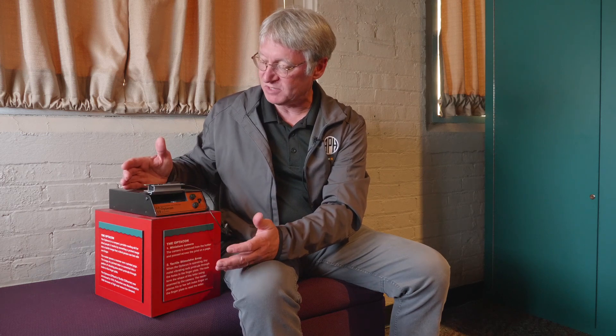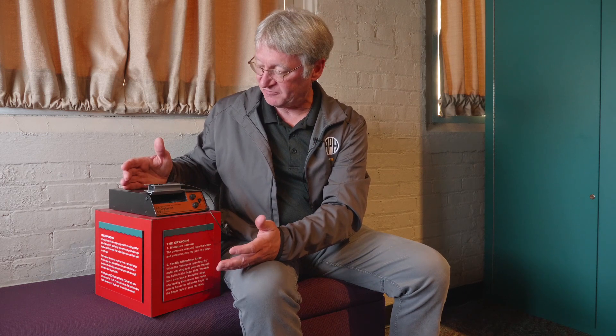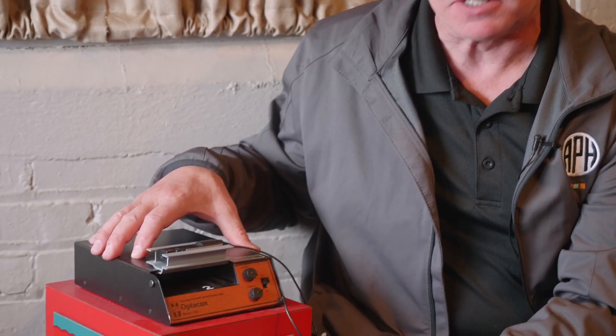It was invented by a guy named James Linville in California, about 1970. His daughter had lost her vision and he was looking for a way to turn print material into something that she could read. He actually worked with a company called Telesensory, and the Opticon was introduced in 1971.